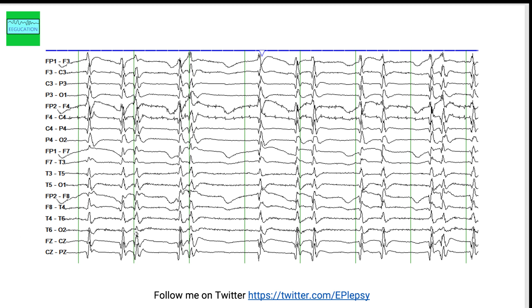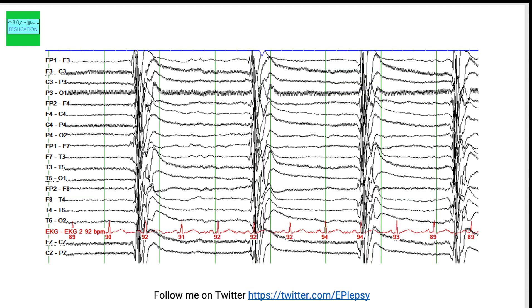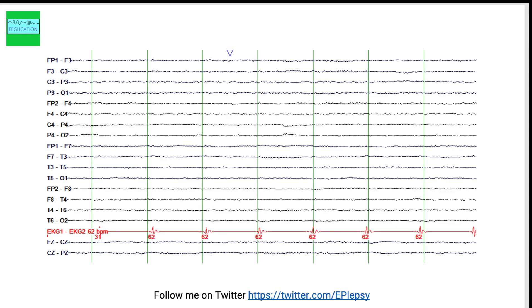This patient had anoxic brain injury and the EEG was done for prognosis. You see generalized periodic discharges, also called GPEDs, with periods of suppression lasting approximately one second or longer. An EEG done 24–48 hours later shows a burst suppression pattern — these are the bursts and these are the suppressions. Burst suppression in the context of anoxic brain injury when the patient is not on any sedation is considered a poor prognosis for functional recovery. A subsequent EEG another 48 hours later shows very attenuated amplitudes.